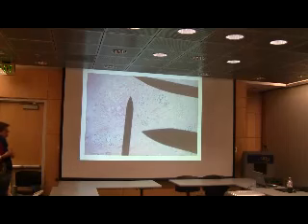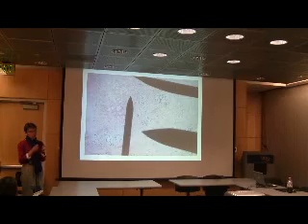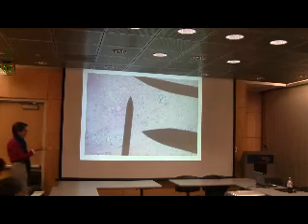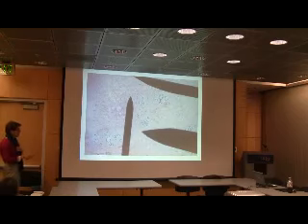All right, so what I do for a living is cytology, and I do a lot of fine needle aspiration biopsy. You can sample the breast in different ways. What we talked about so far is when you have a piece of tissue that has been removed by surgery, and you take a piece of that and embed it in paraffin and cut it. You see such an example here in the background. For instance, here you can see the ductule happened to be cut, so you can see it leading into this particular lobule. This is taken under much lower magnification, so you see it more at a distance.